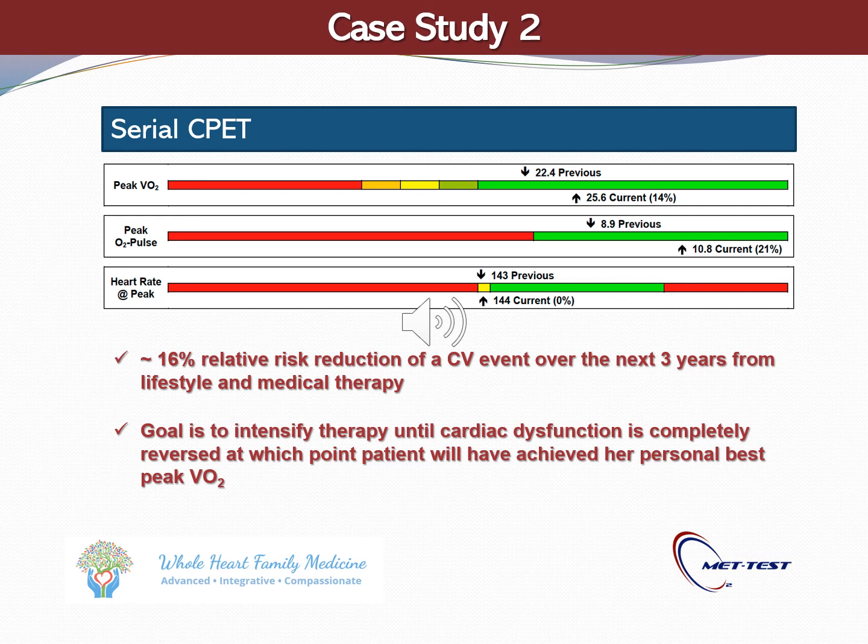The nice thing about the CPET recommendations also for patients, it's the gold standard for exercise prescription, so it can help identify which patients can safely exercise at higher intensities, or those interested in HIIT, versus those who might benefit from more of the moderate intensity. And I typically recommend patients exercise at least 30 minutes or more a day in that moderate intensity zone. I encourage them to get a Fitbit to monitor their heart rate to make it easier, because there's a difference between where the heart rate should be if they're standing up and walking, weight-bearing exercise, or if they're sitting down cycling, the heart rate's going to be maybe 5 or 10 points lower on average.